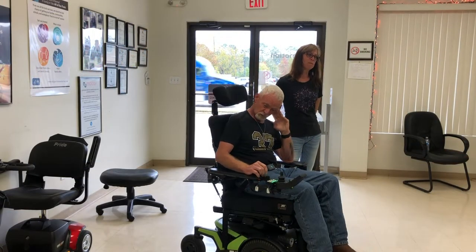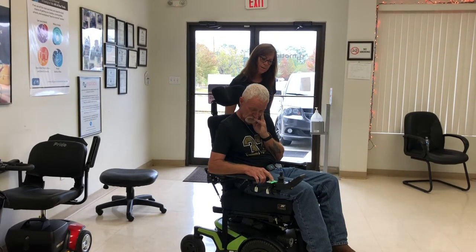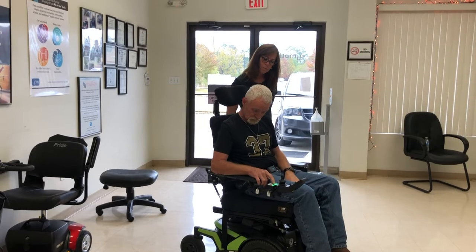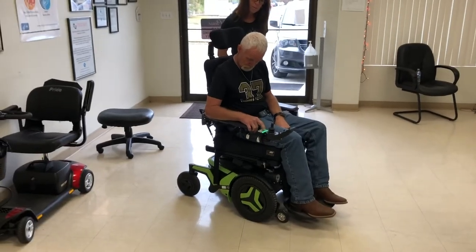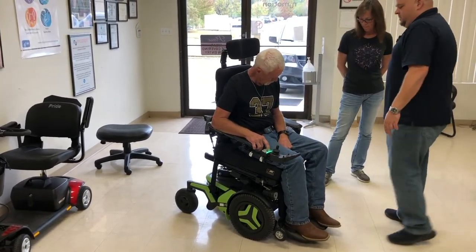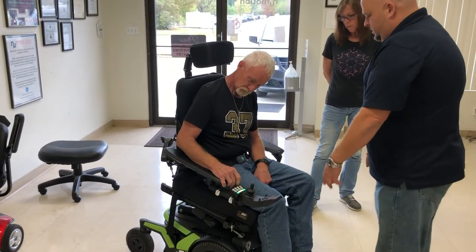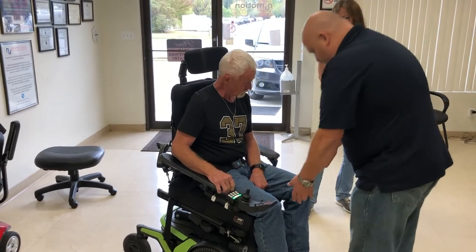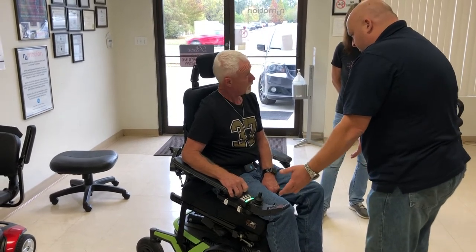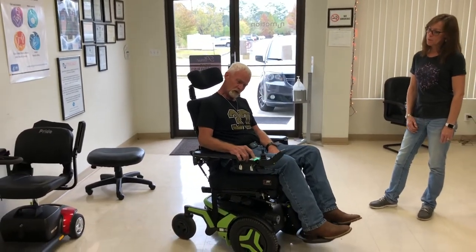Go ahead and tilt through the buttons for me. There you go — tilt it all the way down. This chair has about a five-degree anterior tilt. With that anterior tilt, if you're having a rough day and need help with a transfer, you can go anterior, put your feet on the ground, and you have that little bit of oomph to get up. Now go ahead and do it the opposite way.